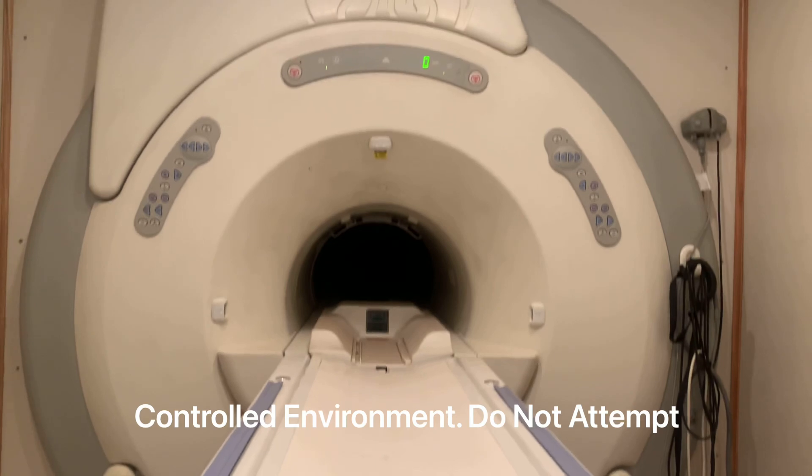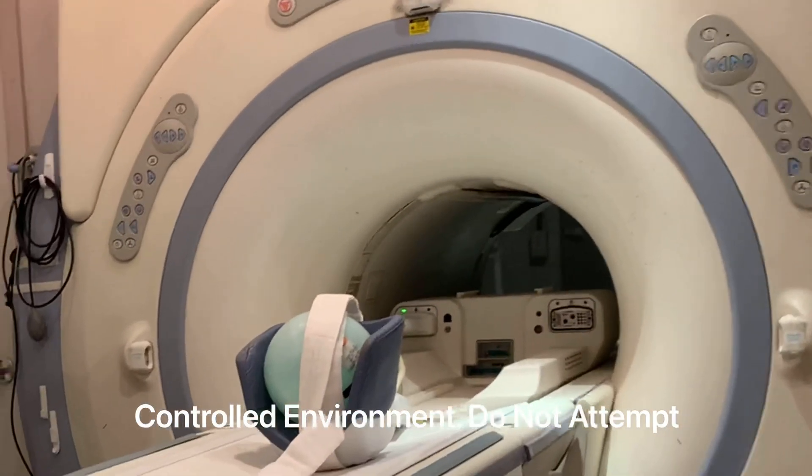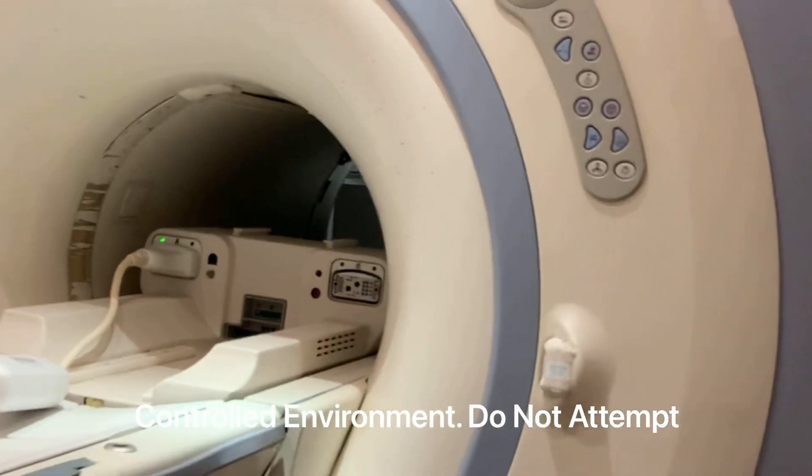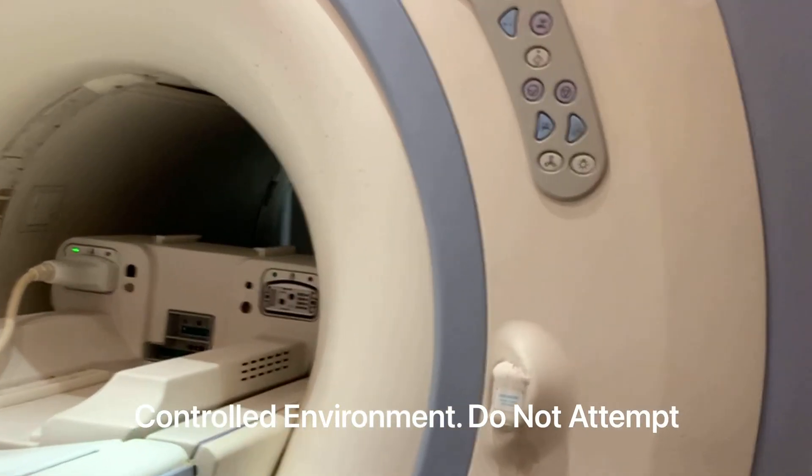Let's bring the camera closer to examine the effects on recording devices as we approach. This test was performed in a controlled environment — please do not attempt. As I'm approaching the magnet, I'm doing my best to mitigate the effects of the magnetic field on the camera by staying 45 degrees from the center bore axis.